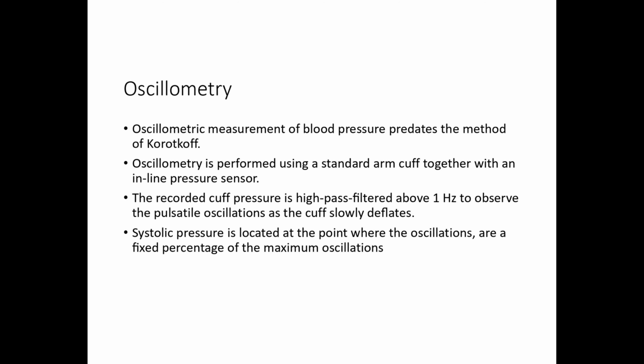So the second method, which we are going to discuss, is oscillometry. Oscillometry is performed using a standard arm cuff together with an inline pressure sensor. What makes the difference is that Korotkoff depends on the sound and oscillometry depends on the inline pressure sensor.